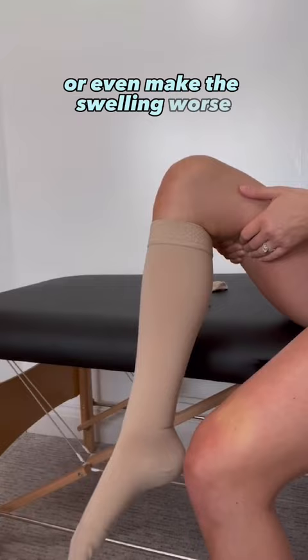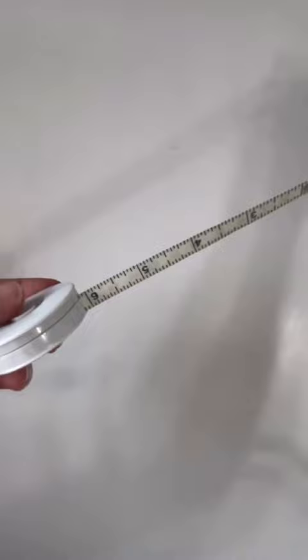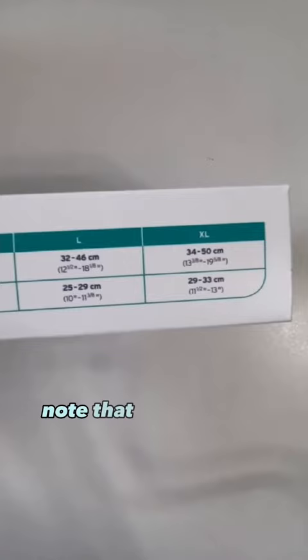You'll need a tape measure with centimeters or inches, and you'll need to look at the brand size chart either online or on the box. Note that every brand has their own sizing, so don't assume that they will be the same.